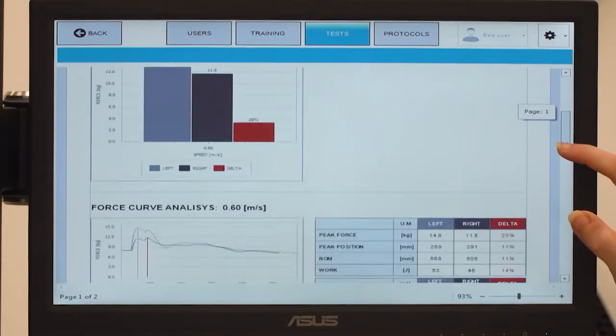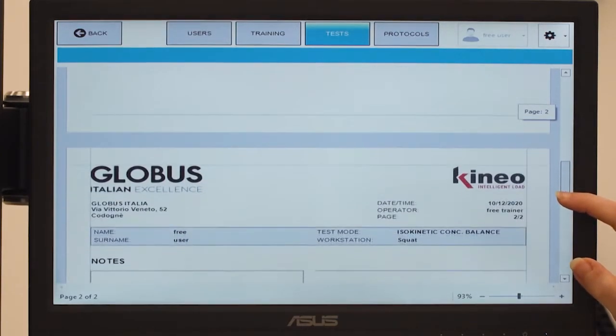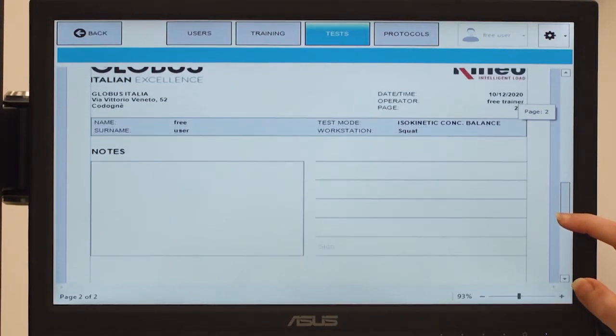The curves analysis allows you to graphically analyze the data collected in terms of strength across the range of motion.